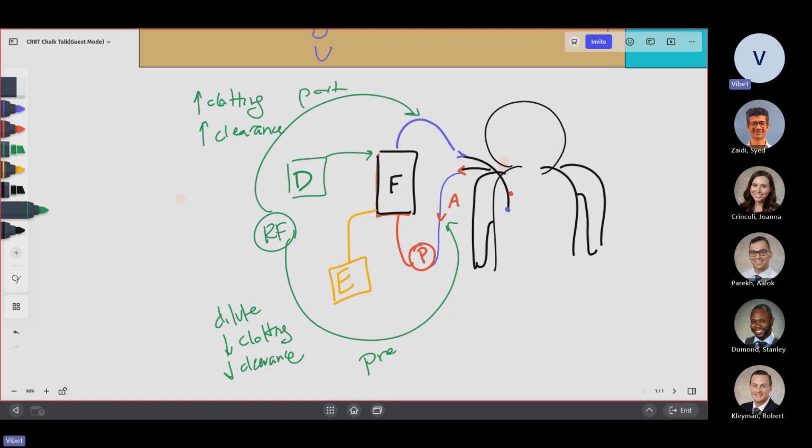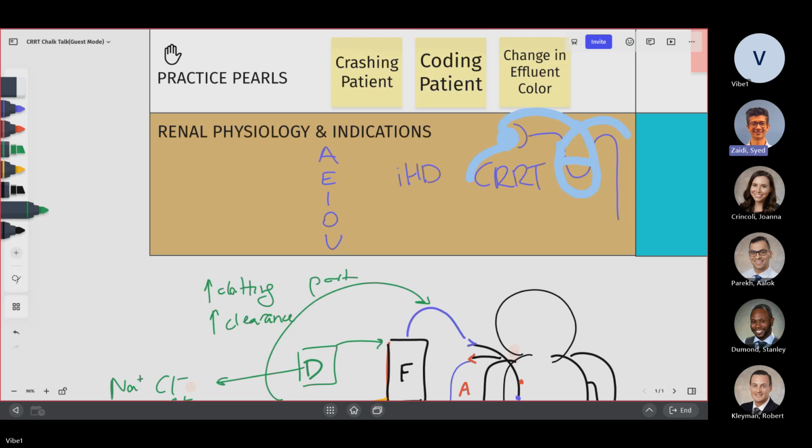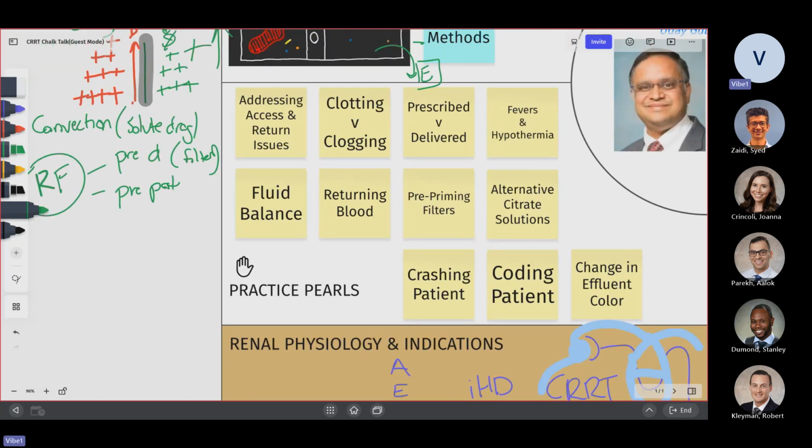When we talk about the dialysate fluid, one of the questions is what's in it. It really contains a mixture of electrolytes: sodium, chloride, and magnesium. The other thing we commonly see, which is relevant to the orders, is the potassium. This is what we refer to as the K bath. You will not see uremic toxins or creatinine; those won't be part of this. That's really what's in your dialysate fluid. There you also have calcium. That's the other one.